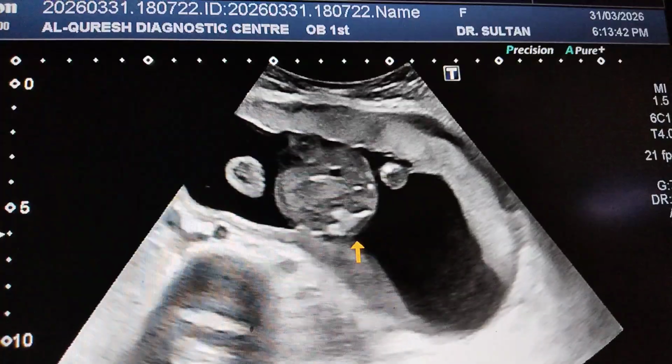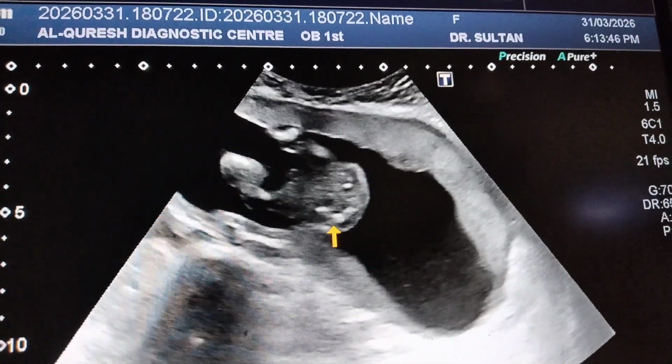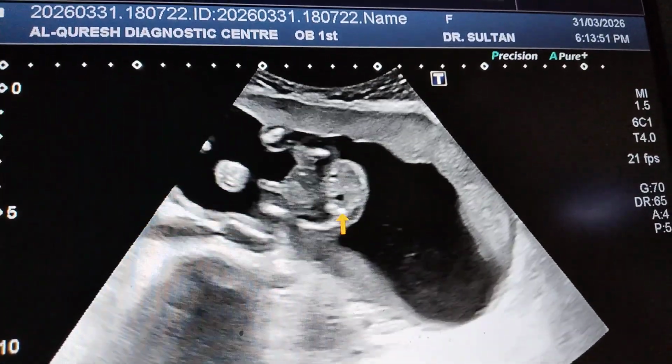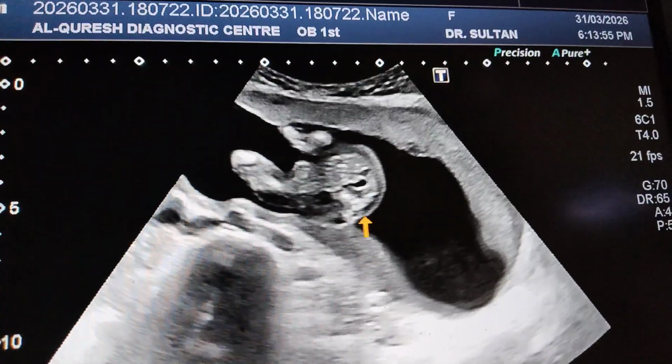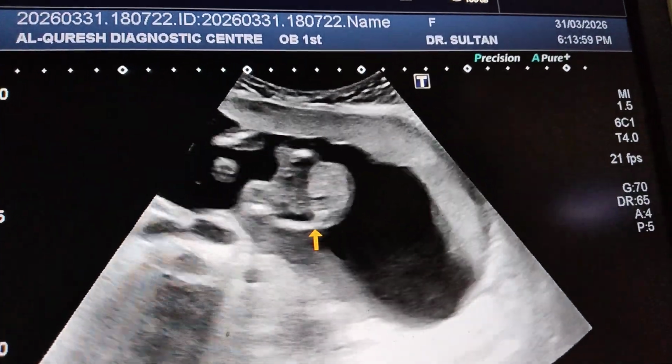So I'm going to take a look here, up till now there is no defect here, no defect here. So the spine and its posterior surface is normal looking.